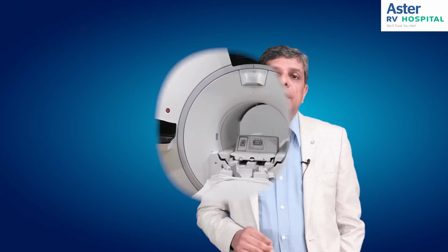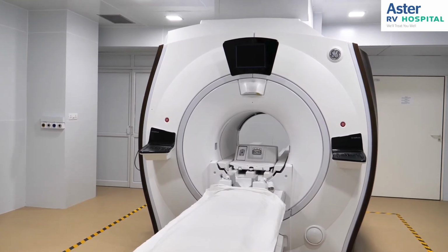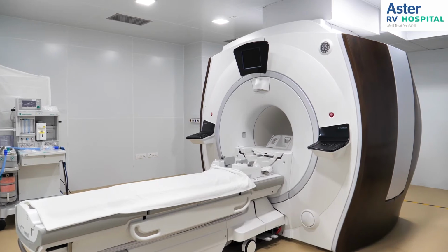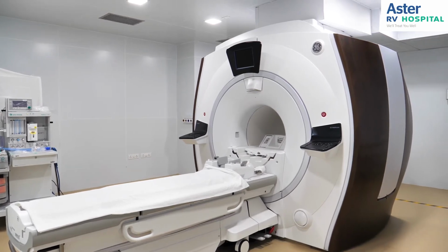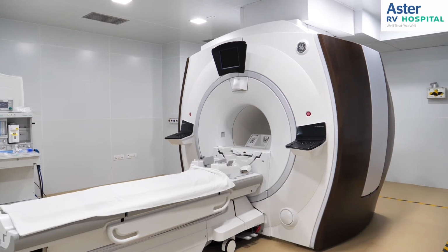We all know that there is a scanning technique called MRI, magnetic resonance imaging. This is usually like a CT scanner but with a large magnet, and it detects abnormalities in the body. From head to toe, MRI can be done. Now, a pacemaker being an electronic device, we cannot take it near the magnetic resonance imaging machine because the magnetic field of the MRI can interfere with the working of the pacemaker.